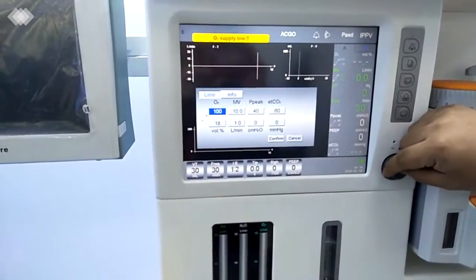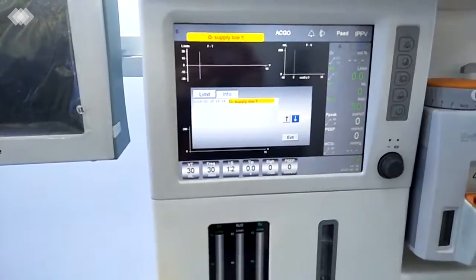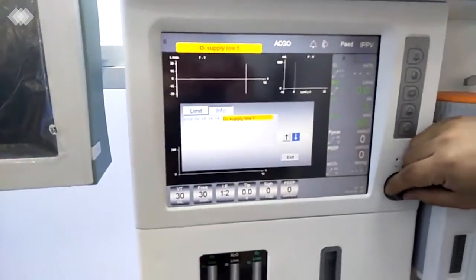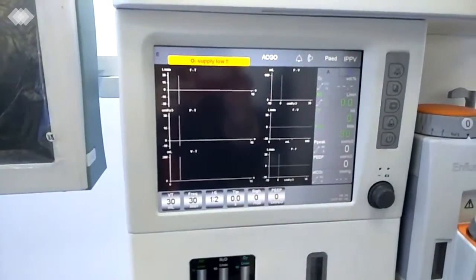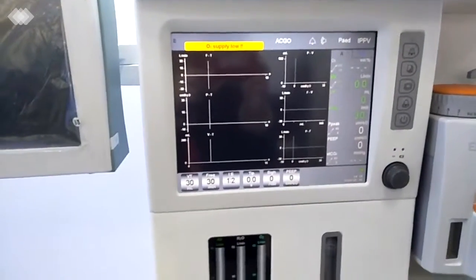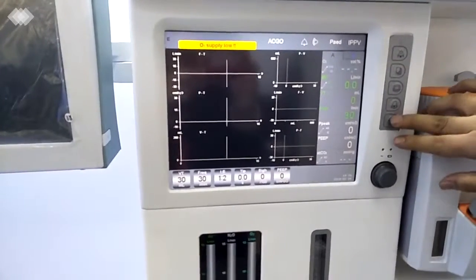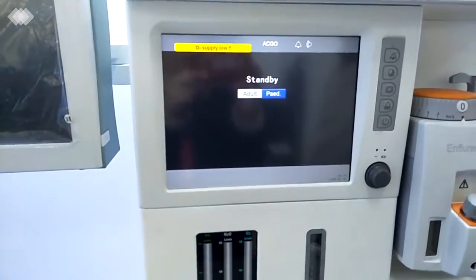And the second one here is for the info. That means after several months, if we want to do the maintenance for the machine, then we can see all the alarm histories here. And then the engineers will know how the machine is running, and what we should do for the machine. And here for the screen, we are using a 12.1 inch big screen. And also this screen is a touch screen. And also here, for the last button, once we press it for 3 seconds, then we will get into the standby interface again.